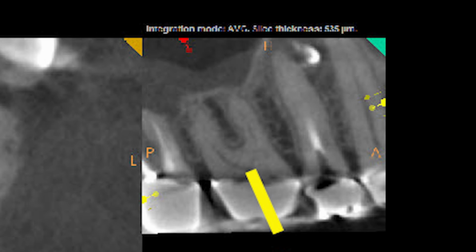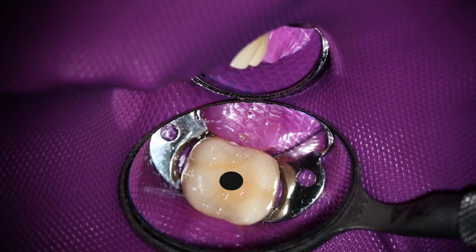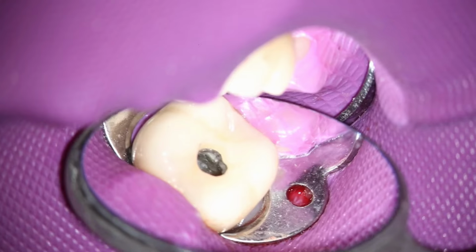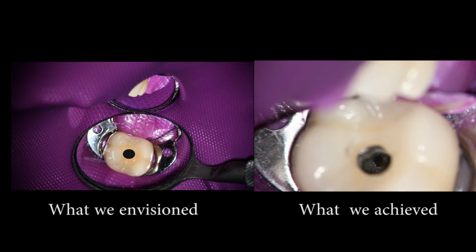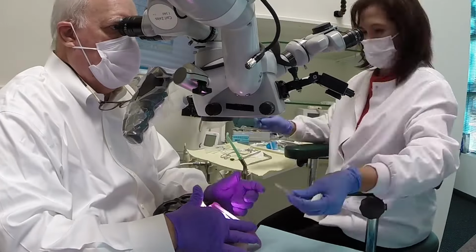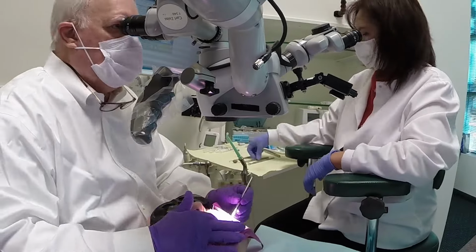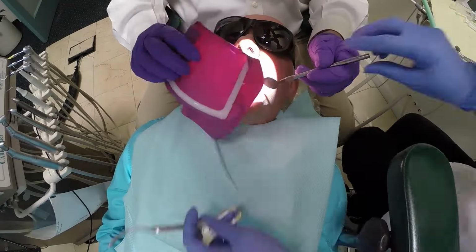And I want to make an access as the diagram shows, right through the center of the tooth, and then see what we have. So that's what we planned, and that's what we ended up with. So let's take a look at how we actually did that without having the assistant be trapped in keeping my mirror constantly clean. So this is speeded up, but if you look at where I have the mirror, it's down near the bottom of the rubber dam frame.